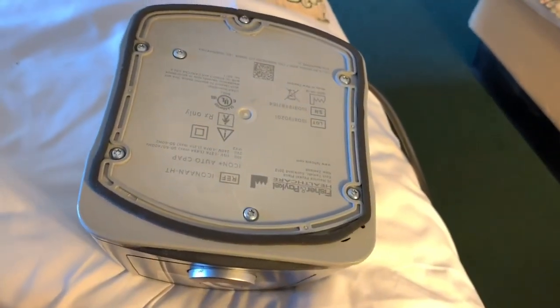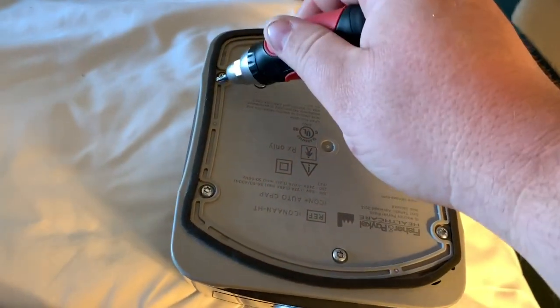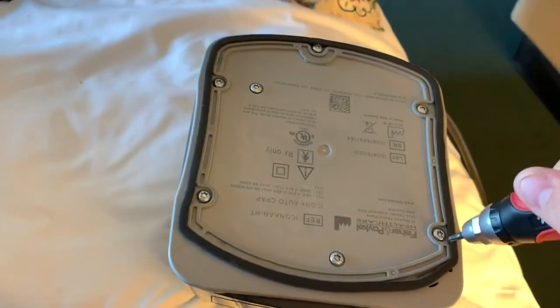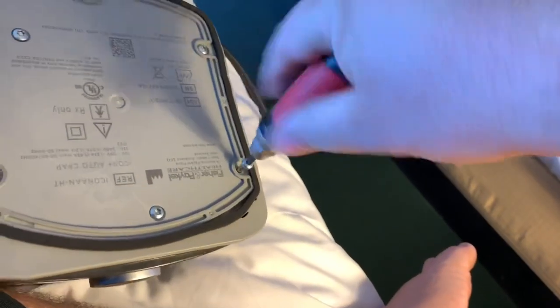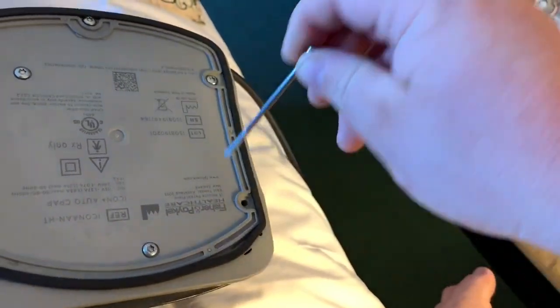At the bottom, you see there are screws. The four on the corners are long screws, and the three in the middle are shorter. It's kind of a pain, but you just want to start unscrewing them. The ones at the bottom are longer. Get them all out.